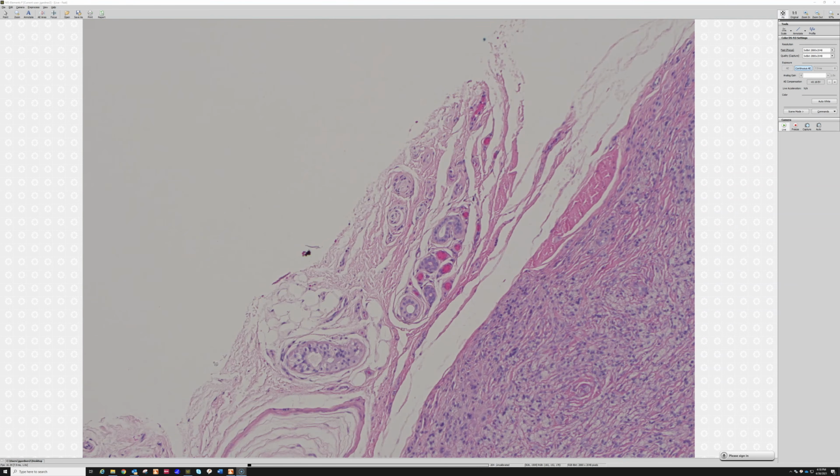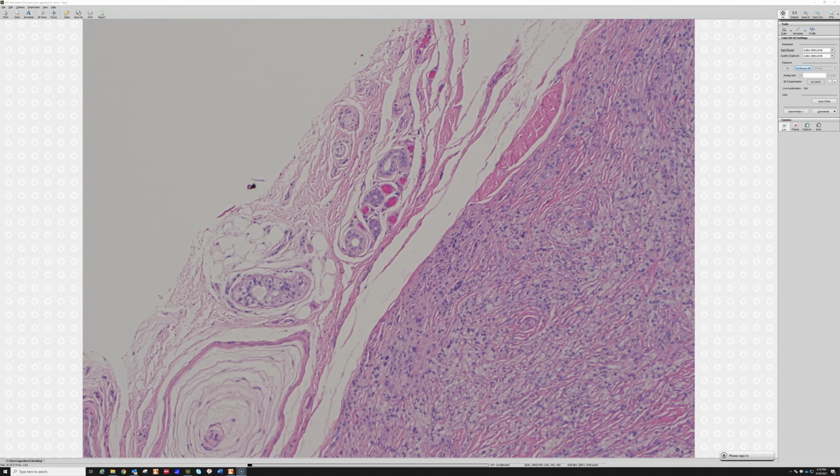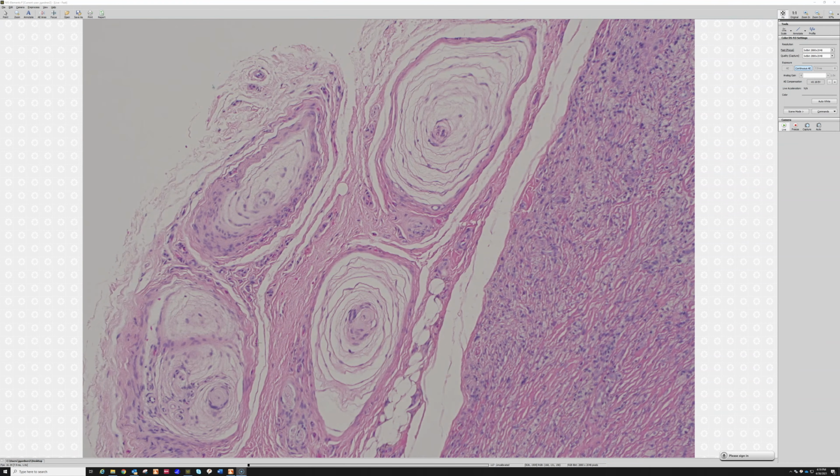And then here, look at that. We've got eccrine sweat ducts or glands or eccrine coils. So in the acral sites, the palms or soles, you'll see a deep nodule that's down at the level of almost the tendon sheath, and at the same time you can see skin structures because there's not very much space there between the epidermis and the bone, only maybe a centimeter or so in some areas on acral sites.